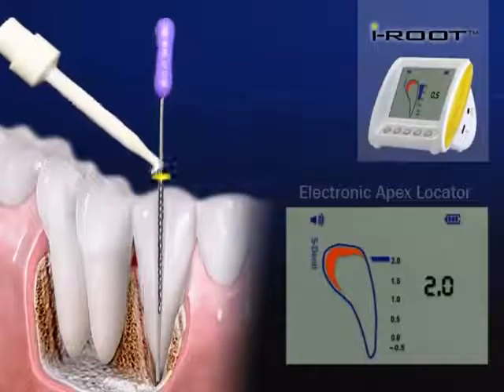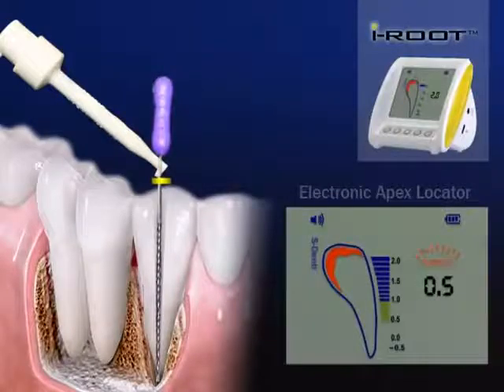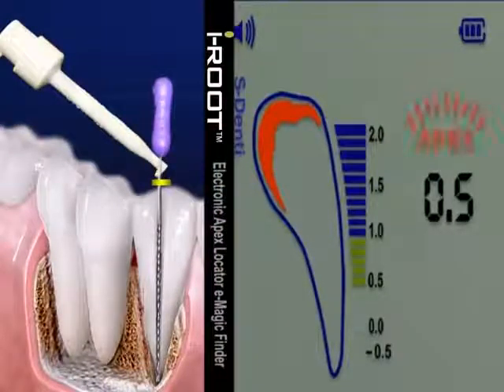Insert the file and slowly move it forward while rotating it gently under the meter on the screen that shows 0.5. When it reaches 0.5, the word APEX in red letters on the screen flashes and the beep becomes strongest.